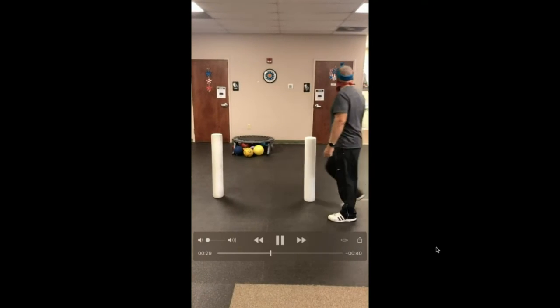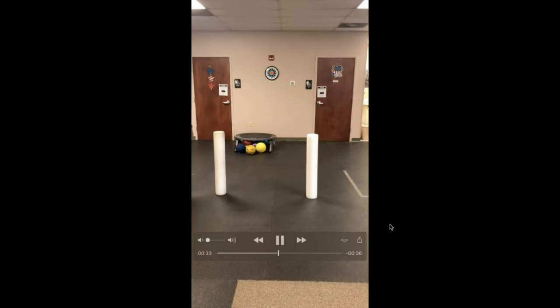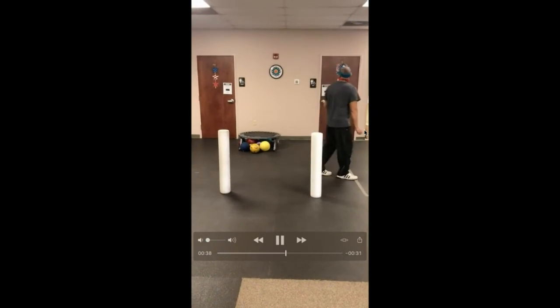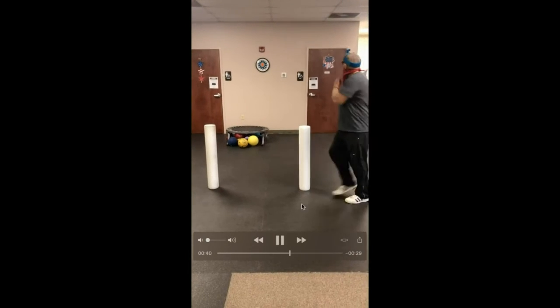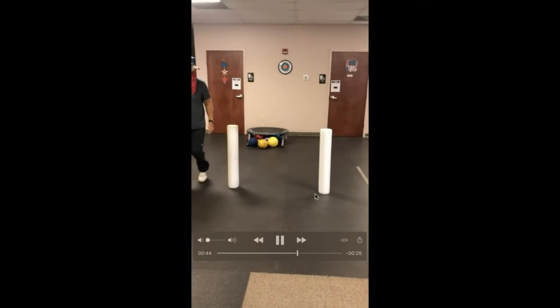All right. So going through. As he's going to the left side, he likes to come back, and he's precise coming back onto the target on this side. As he goes through, he has to take a wider excursion here, and he can't get the laser back up there very quickly.